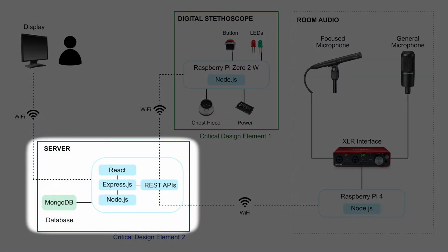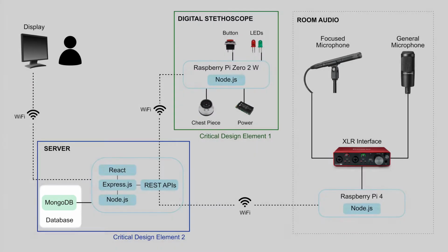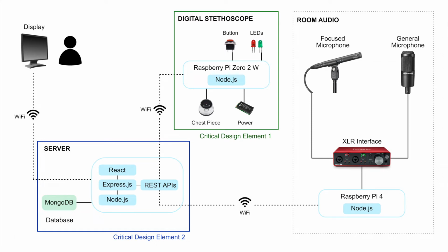We determined that the best design for the web app and server to meet these requirements involves using a MongoDB, Express, React, and Node.js stack. MongoDB was used to create the database responsible for saving user, patient, and device data. This allowed us to save user login information, basic patient data such as name, birthday, and sex, and device information that enables us to pair the device to the server.